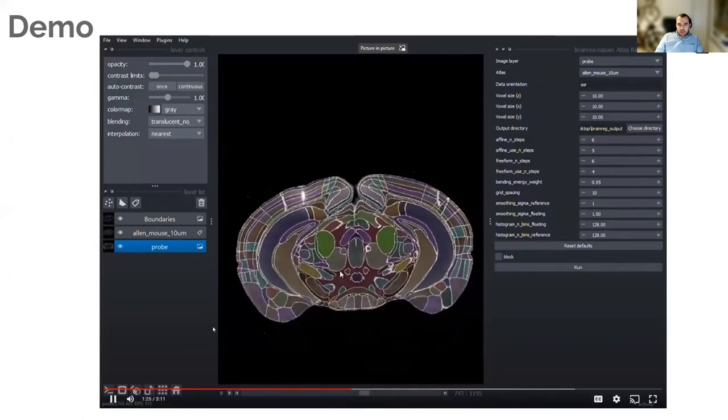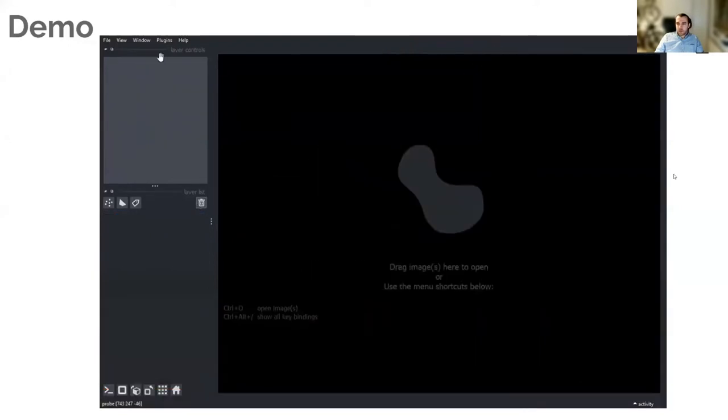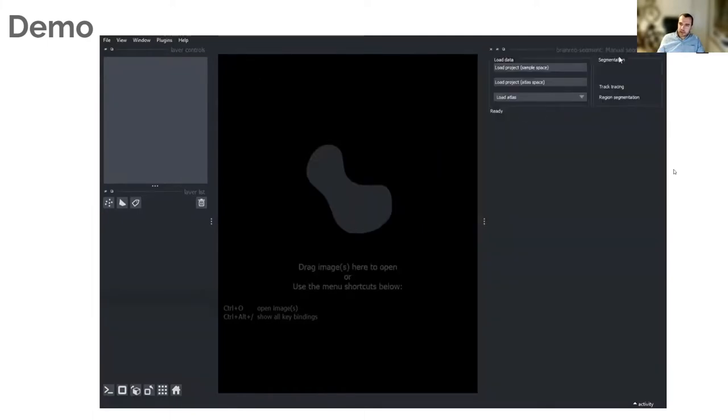For this, we use a different plugin. Just for this demo, we're going to delete all the data, close this plugin, and then open up the new plugin which is called BrainReg-segment, which basically just takes the output of the last step. So you load your output directory from the last step. You can do this analysis either in sample space or in atlas space. In this case, we're going to do it in atlas space.